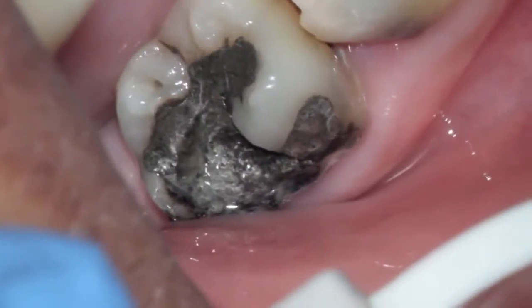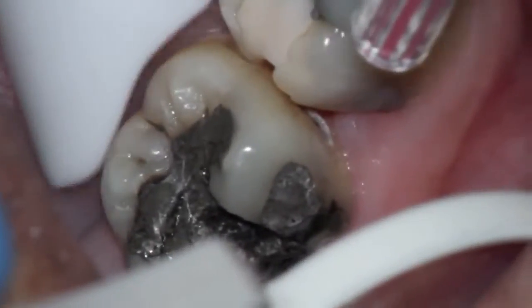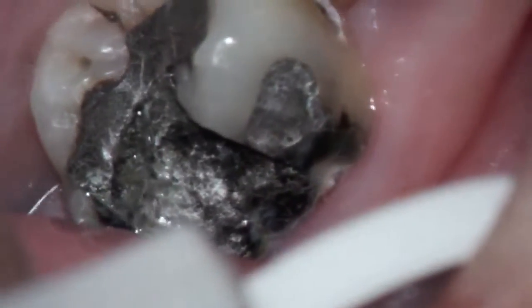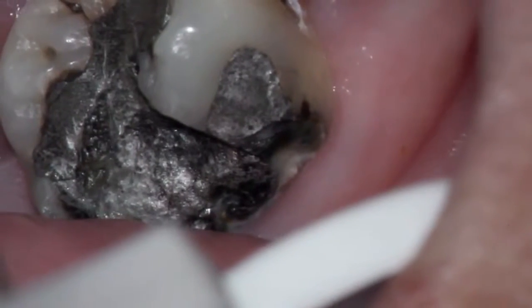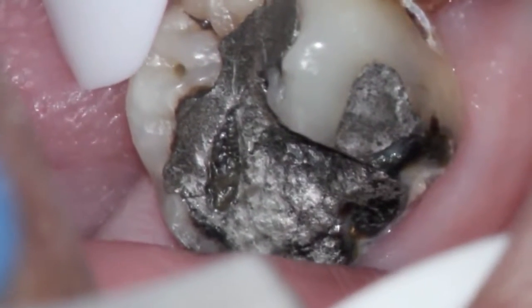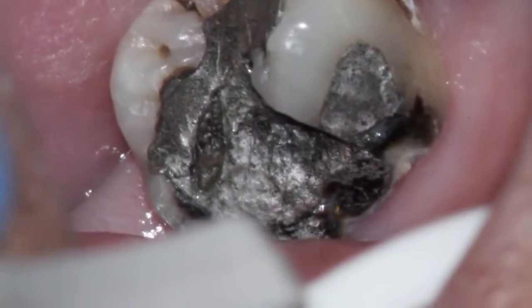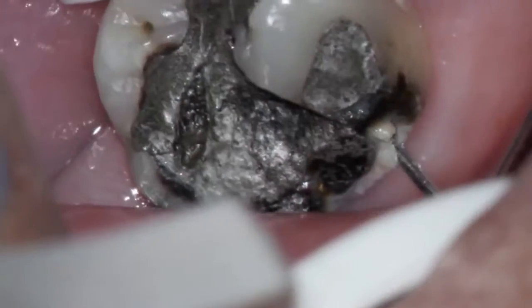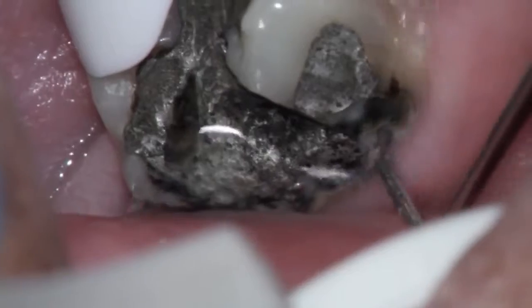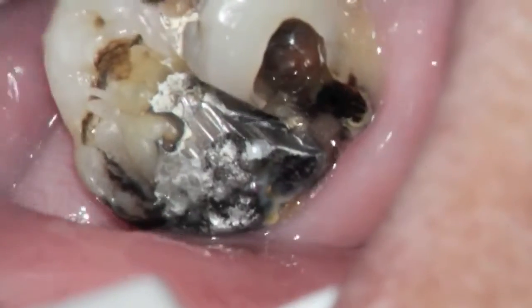And as we take a look at the area near the tooth, by the gum area, there's all sorts of decay that will be present. Where you see a little whitish material, and I take a little explore, you'll see that we can get actually up underneath the silver filling, and that was where the decay first started. Possibly there was decay left behind as well when it was originally done. There's also a small little cavity there.